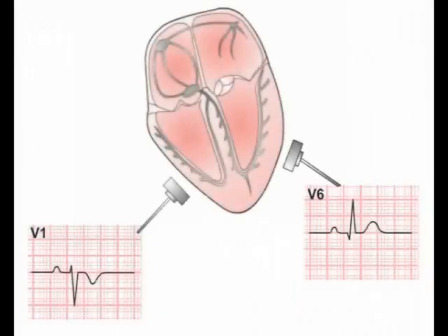how the cardiac depolarization and repolarization waves spread through the heart. Now we will go on to explain how these electrical events are analysed by the ECG leads to produce the waveforms of the ECG readout. Again, we will work with the 2D schematic of the heart as explained in video 1 of this section.